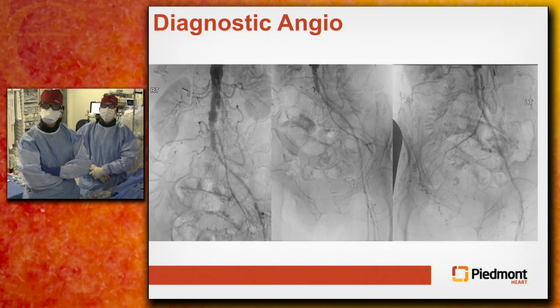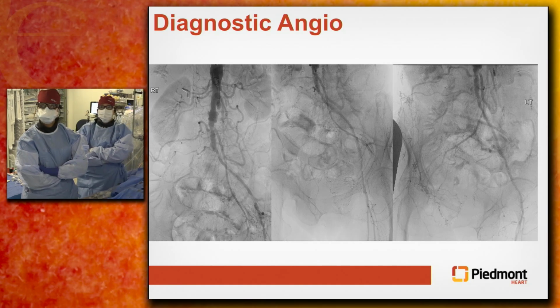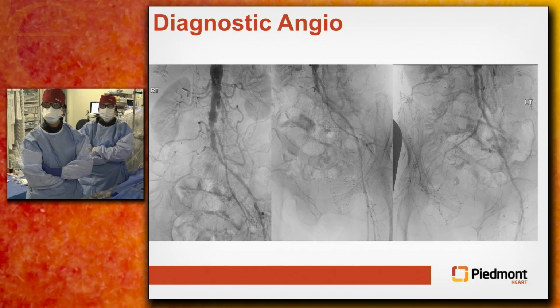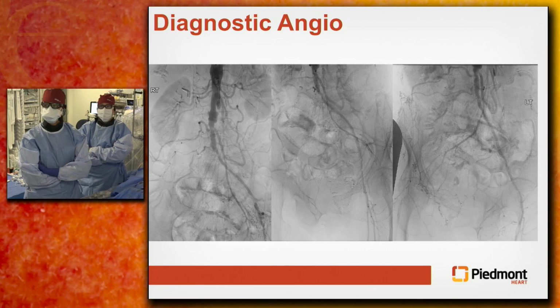Next slide, please. So we did a diagnostic angiogram from the right radial approach. You can see here her renal arteries are the only thing that looks good. The distal abdominal aorta has severe diffuse disease. We have no real beak from above, and essentially not much reconstitution in the right common femoral as was promised on the CTA. You can see on the left there's some disease in the left CFA as well as moderate disease in the external iliac as well as in the proximal common iliac.